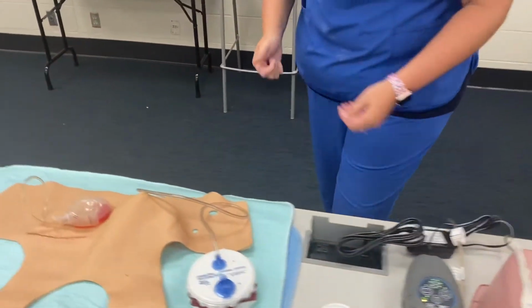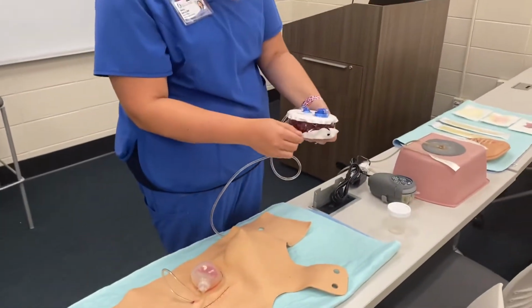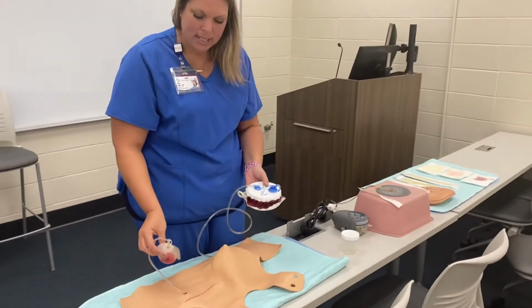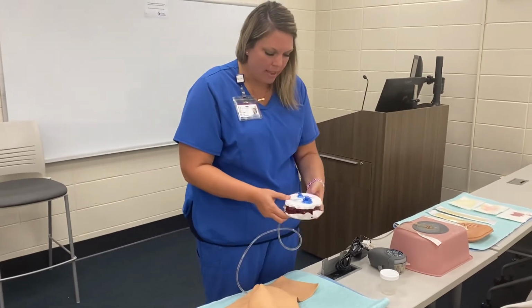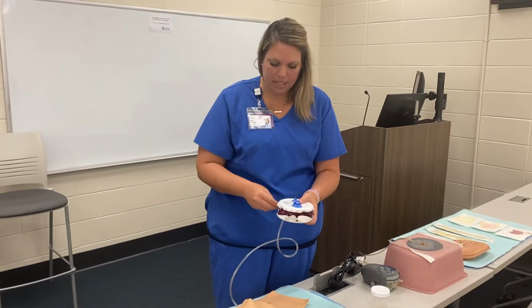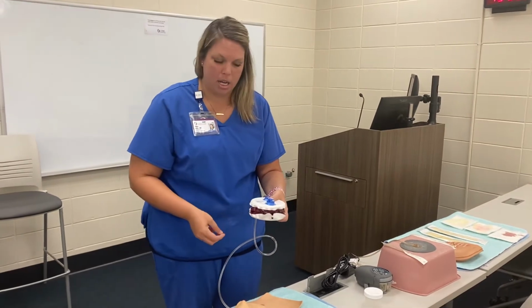All right, the next drain you talked about that you will see is a HemoVac. Okay, so this is a mastectomy setup. This patient has a HemoVac coming out of one side and a Jackson Pratt or JP drain coming out of the other side. So with this HemoVac, all it does is it compresses, and it's slowly using vacuum from that compression to pull out drainage, okay?